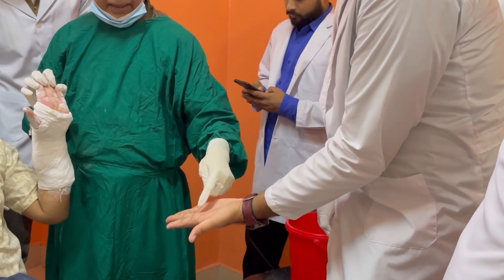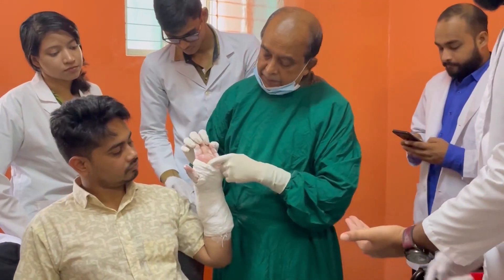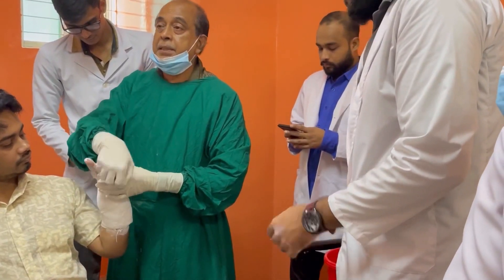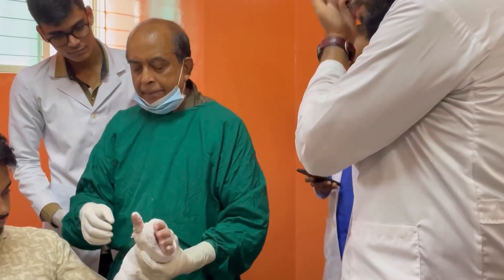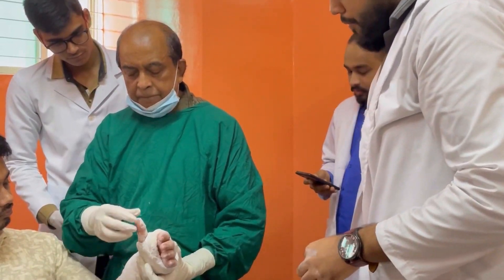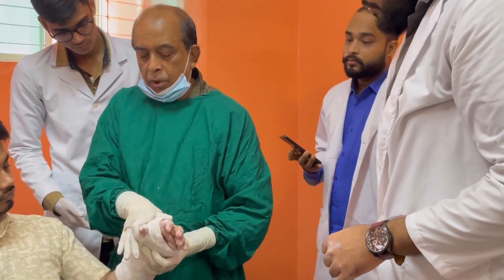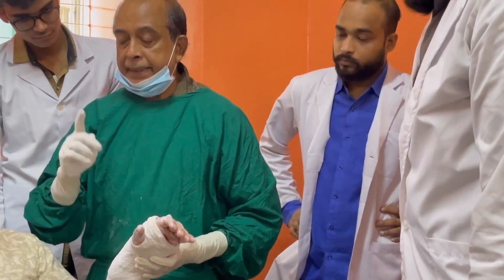The exercises for the patient may now be explained and demonstrated. They include full flexion of the MP joints, full flexion of the PIP joints, and placing the ends of the fingers into the palm of the hand. The forearm cast should not be too wide in the web space so that the patient can continue to pinch the thumb and fingers together.